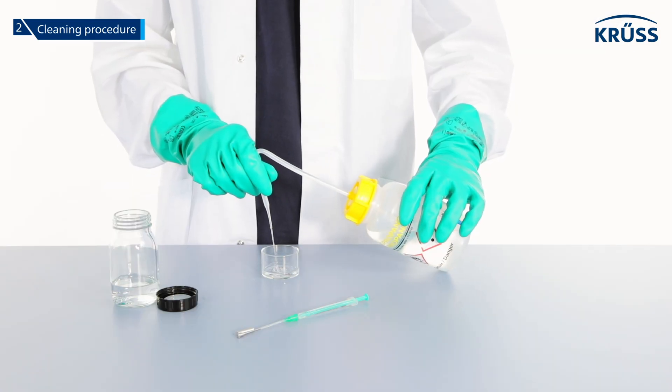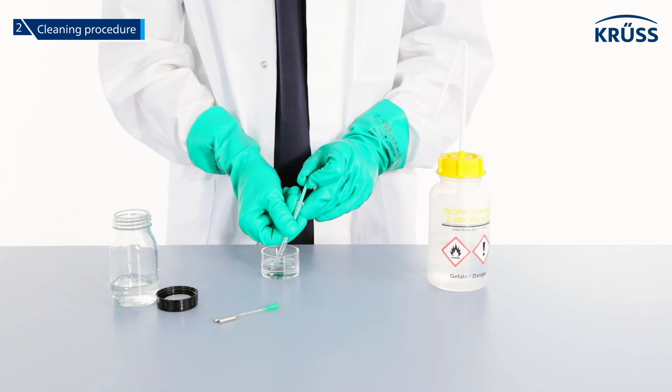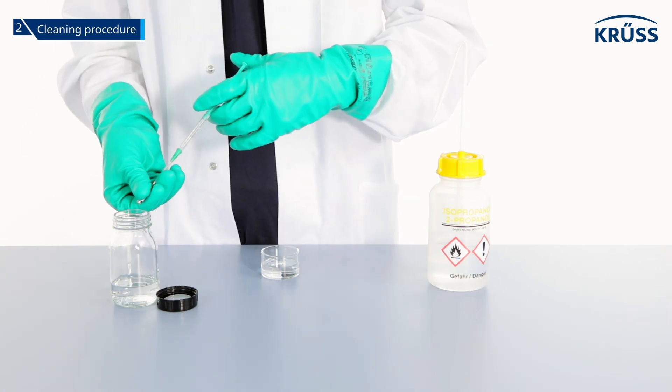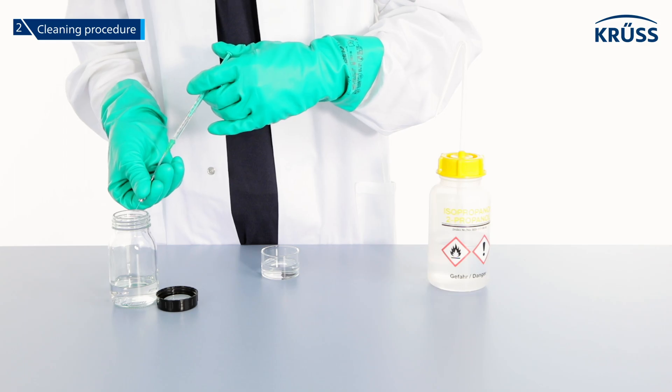Fill a clean sample vessel with isopropanol. Fill the syringe with isopropanol and push it through the plastic needle and the valve into the waste vessel until the syringe is empty.